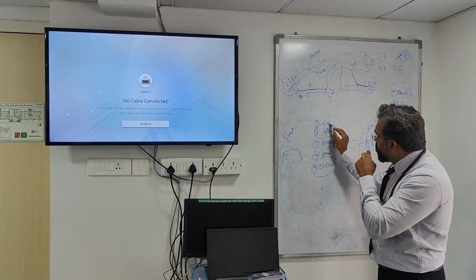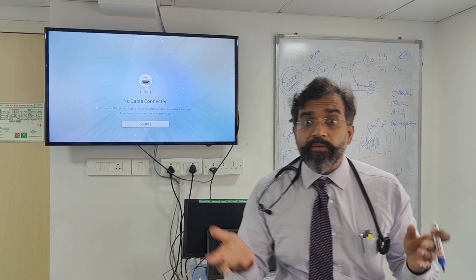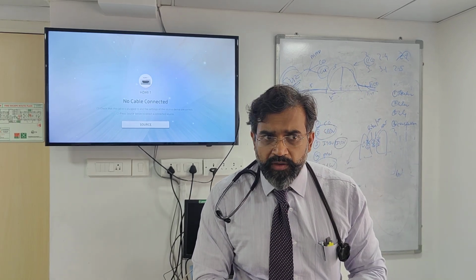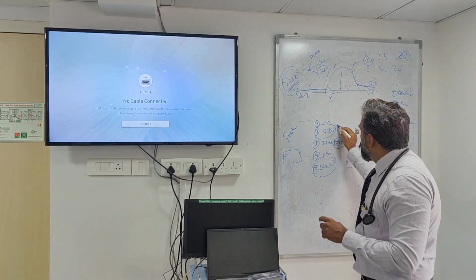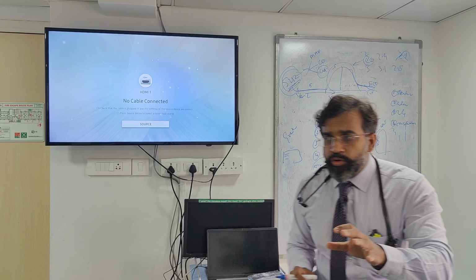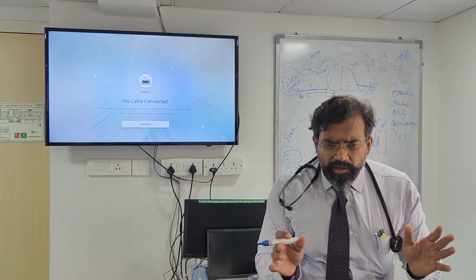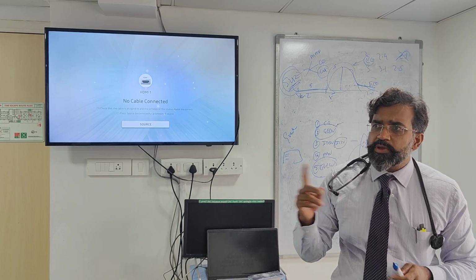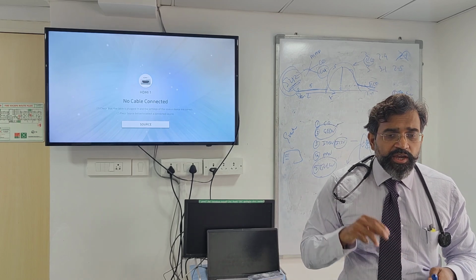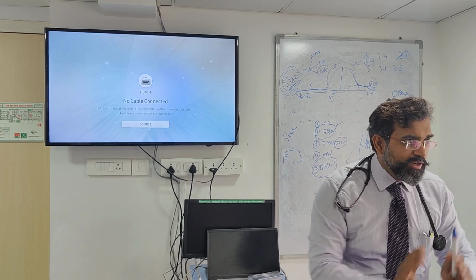So now you have global end-diastolic volume, a fantastic value. This value tells you how much volume is there in the heart. An actual hypovolemic patient will have very low global end-diastolic volume. It's not 100% like that, but you can say, this patient's heart is looking hypercontractile, I am finding the extravascular lung water on the lower side, and in proportion to that, the global end-diastolic volume is also low. So I am near about certain that this is hypovolemia.